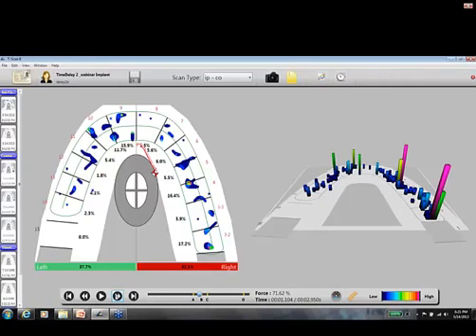Now the implant may not fail, but maybe you fracture the crown or there's a lot of different things that can go on here. There's 18% of force on this tooth, and our center of force trajectory is moving off to the right.